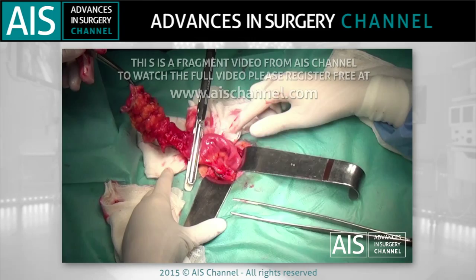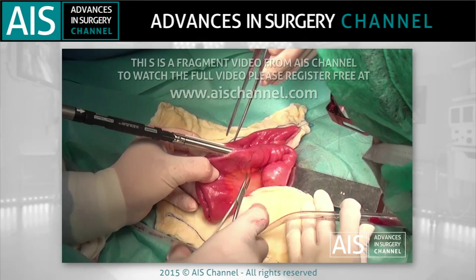Two loops of continuous small bowel are measured, 18 cm each, and placed in parallel.